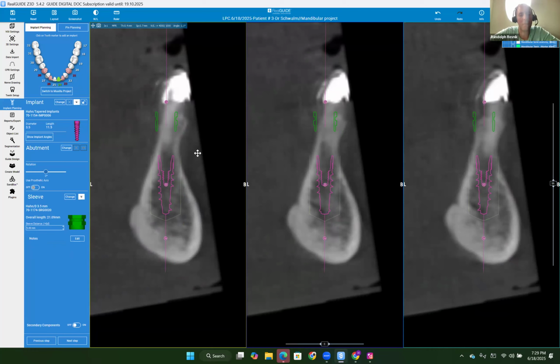Now, in terms of the incisal edge position, are these teeth at their appropriate level or have they super erupted upwards on you? They're pretty close to where it is. She's comfortable at that vertical, so if I change it, it won't be much. Okay. So when you're making the interim denture, you're going to pretty much keep it at that incisal edge position? That's the plan, and if she functions well, try and keep her there for the long term. If we need to adjust it, we have the opportunity to do so because we'll be doing a new one in a few months anyway.